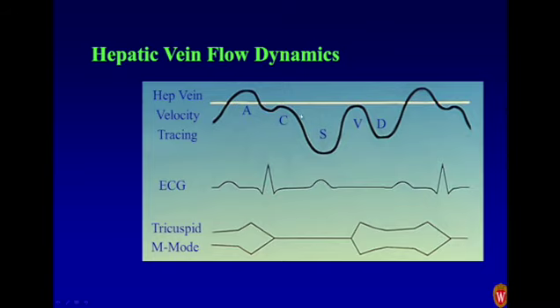The atrium is open and relaxed, but its velocity starts to slow down to the point where it actually may spit backwards a little bit if it overfills, but in most people it may come to a complete stagnant point or just slow down significantly.